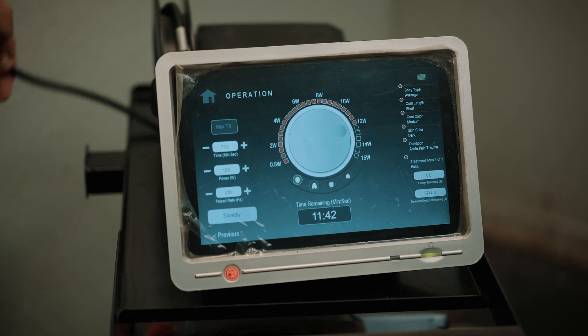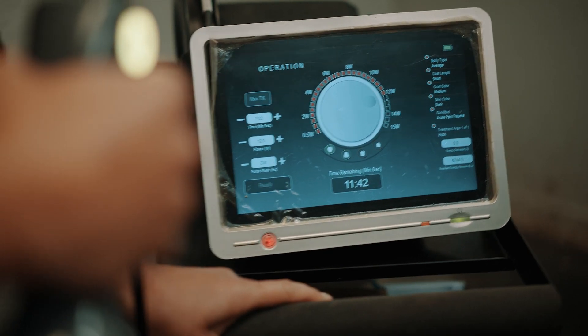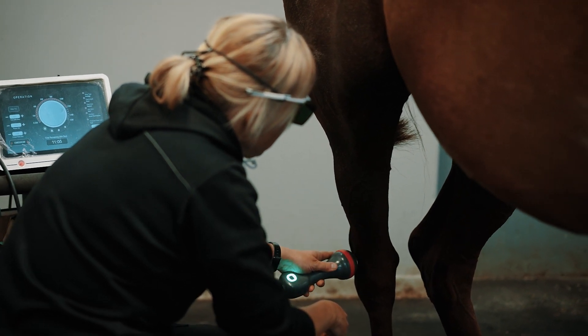The Companion Laser is easy to use, it's quick, and we can treat a larger area. A horse is a big animal so we save a lot of time. It's portable — I can bring it to the stable or we can have it here at the clinic.